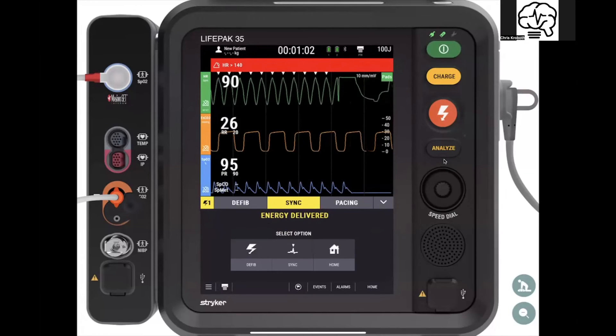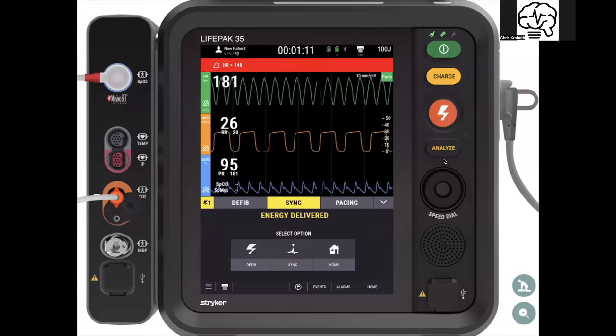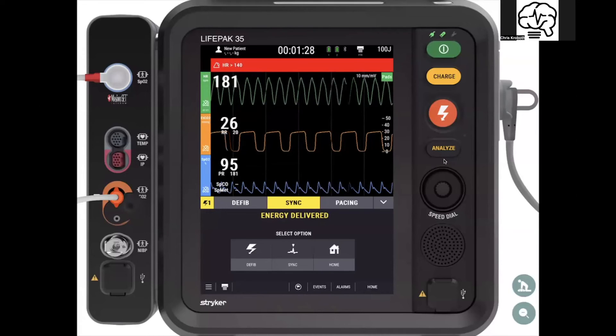Clear — we're all clear — shock — delivered. This is a cognitive offload, human factors, safety masterpiece. Just the other day, a provider got so nervous on a V-tach patient that they double-tapped the sync button because they were jittery. Here, we synchronize cardiovert the person, deliver the energy, and it gives you essentially: did they convert? Are they in the same rhythm or did we fix them?